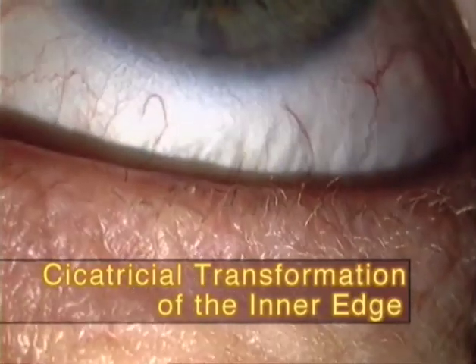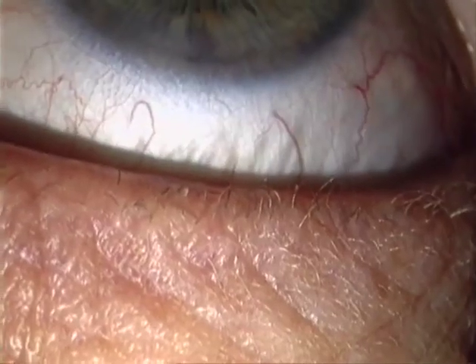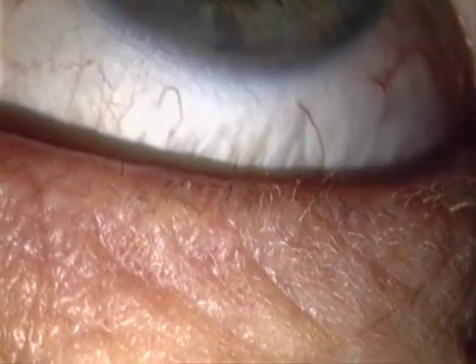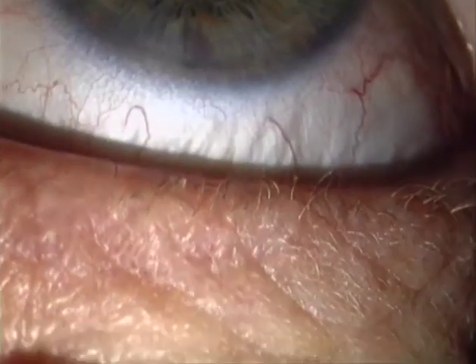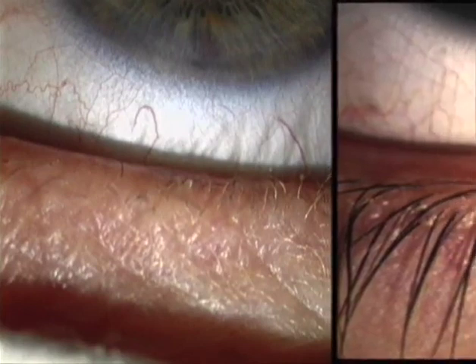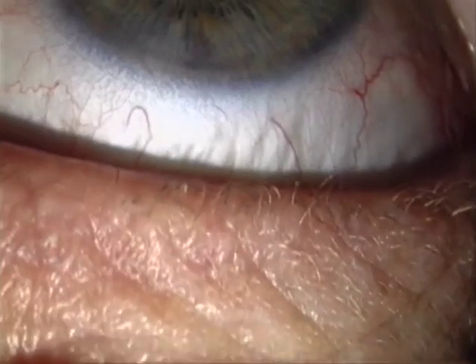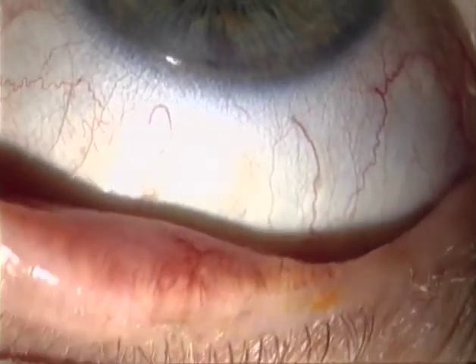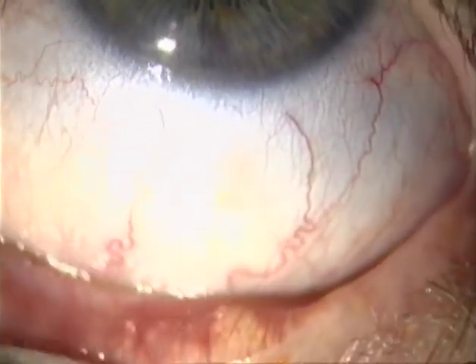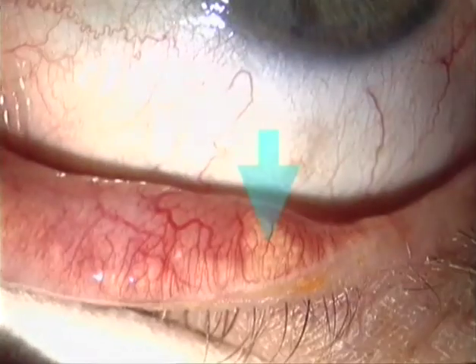To demonstrate an example, let us go back to the first case shown in this program. When the lid is seen from the outside, we notice only the abnormal direction of the lashes which point upwards. Compare this with the position of the lashes in a normal lid. When the lid is everted, we hardly see any changes at first glance. The conjunctival vessels show no irritation, and through the transparent conjunctiva, we can recognize some enlarged acini of tarsal glands.